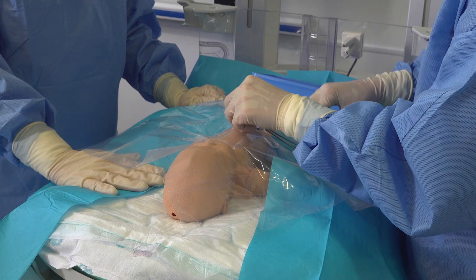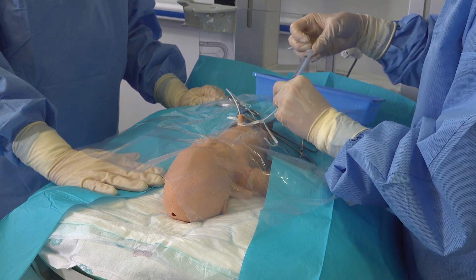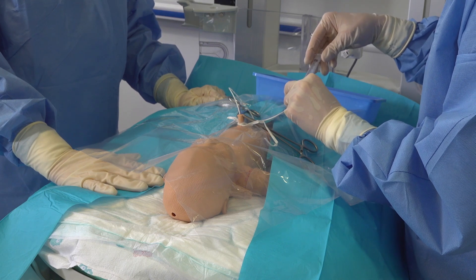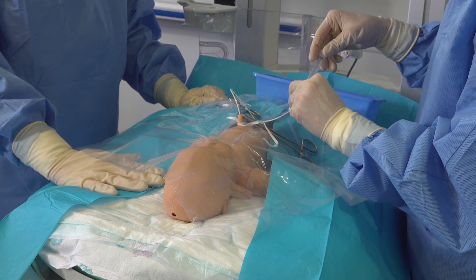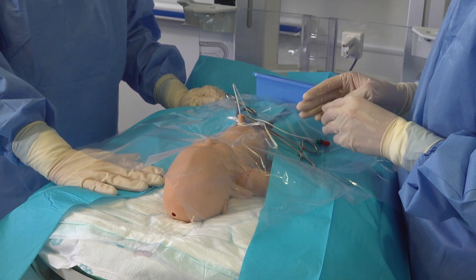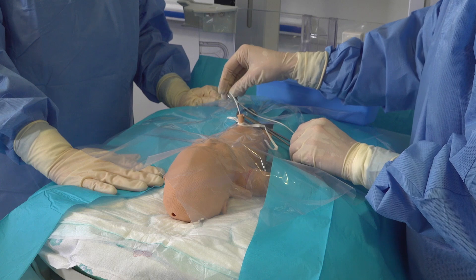Once you're at that desired distance you can then check to see if your UAC aspirates any blood to confirm that you're in the correct position. As this is a dummy we will not see any blood aspirated today. Once you're happy that your UAC is in the correct distance, leave it to the side before now inserting your UVC.